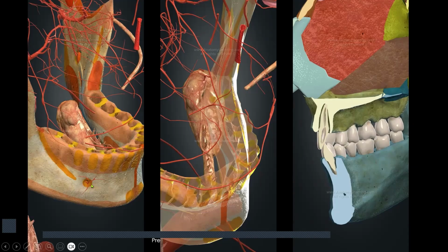So in the anterior region, you have to place the implant from the mental foramen to the midline, or we can say the interforaminal region. From this foramen to the foramen of the other side, you place the implant. That is the interforaminal region, and this region is a highly corticalized, highly mineralized area. So in the anterior region, you place your implant in the interforaminal region, and behind this mental foramen, we place the implant posteriorly.